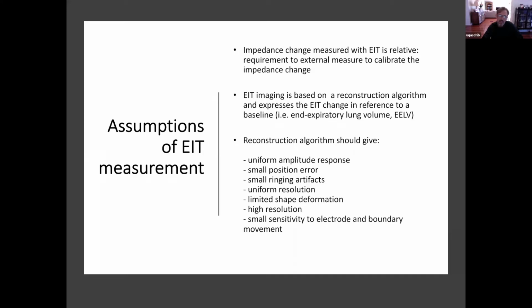The GREIT algorithm that is mostly used is probably one of the most advanced, but again based on a lot of assumptions. We're getting better with it, but we're certainly not there yet and accurate as, for instance, the measurement of lung volume with a CT scan or other technology.